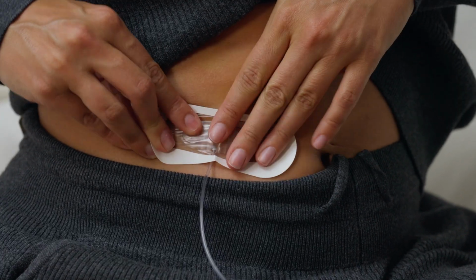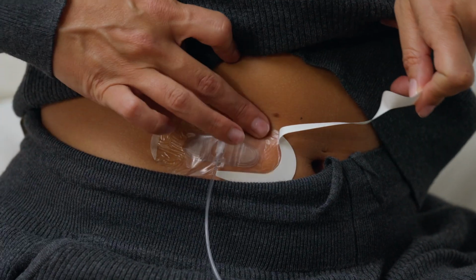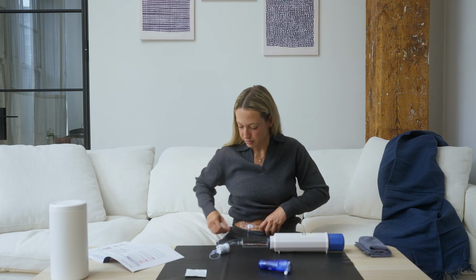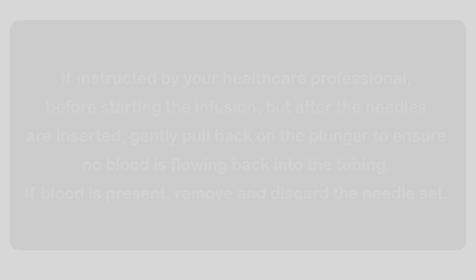Place the soft site dressing over the needle set. Note the window does not contain adhesive for easy application and removal following infusion completion. If instructed by your healthcare professional, before starting the infusion but after the needles are inserted, gently pull back on the plunger to ensure no blood is flowing back into the tubing. If blood is present, remove and discard the needle set. We can now start the infusion.